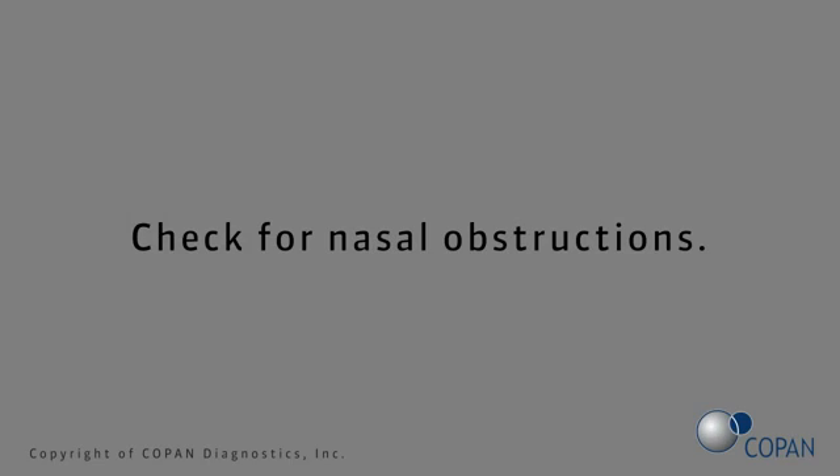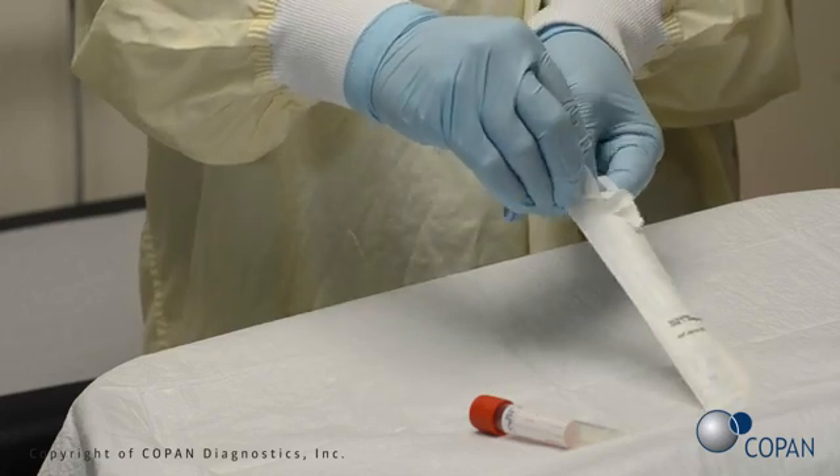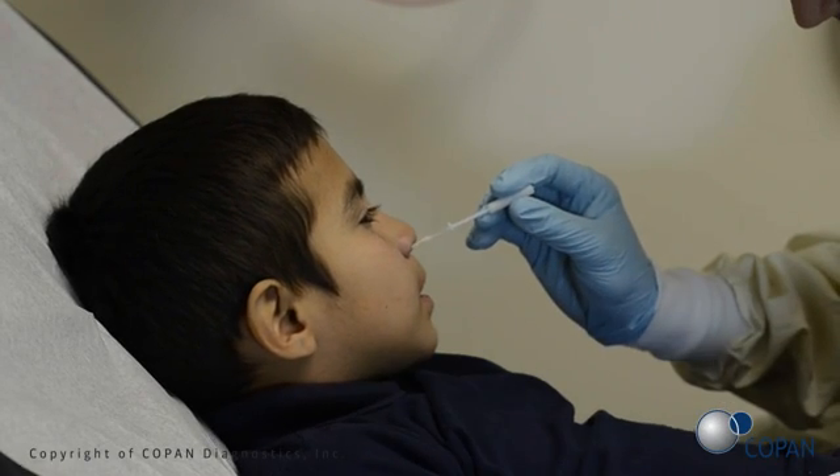Check for nasal obstructions. Open swab package. Gently insert the swab into the nostril.